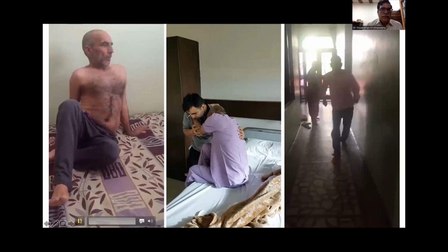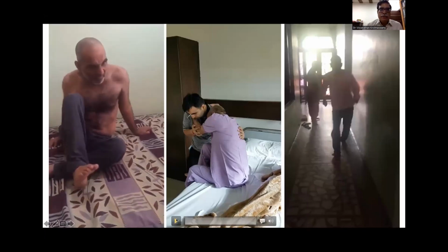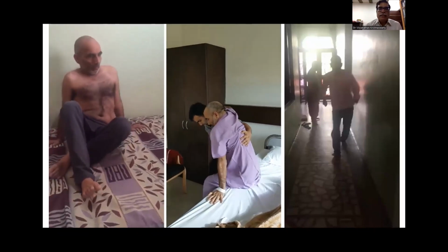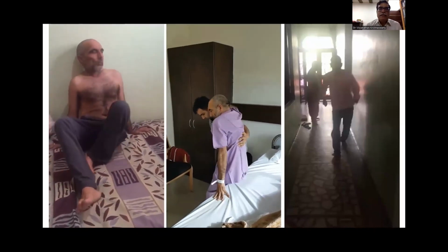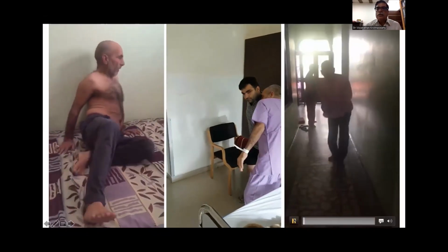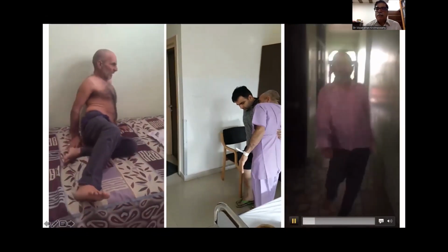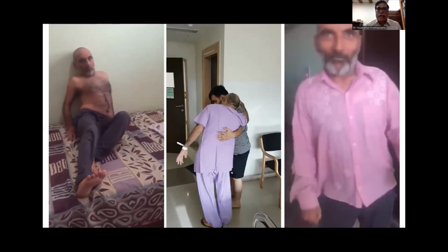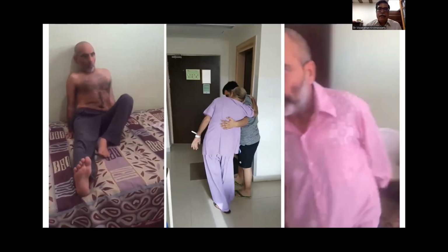Now, this is a patient with generalized dystonia. This is an elderly gentleman who's been suffering for decades. This is a DYT1 gene positive generalized dystonia. And the third video, this is the one with about a month or so after surgery. And you can see that sometimes DBS can be life-changing.